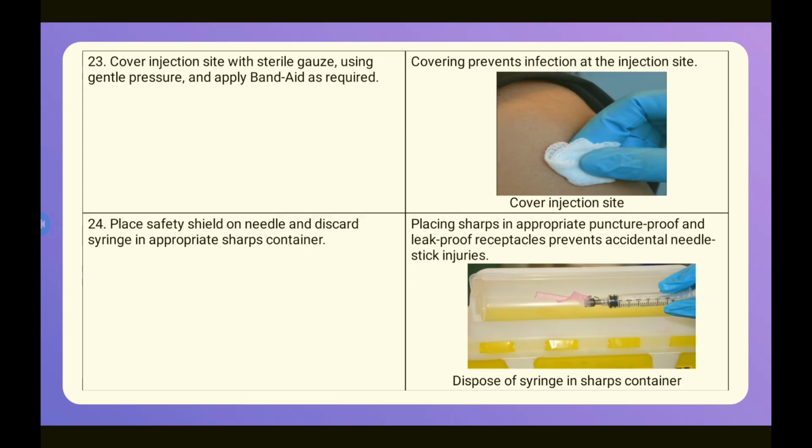Number 23. Cover the injection site using the sterile gauze between your 3rd and 4th finger. Use gentle pressure and apply a band-aid as required. Covering prevents infection at the injection site. As you see, we cover the injection site.